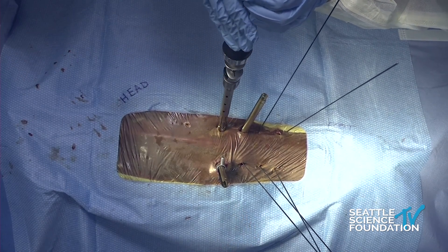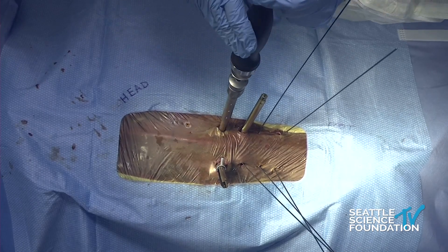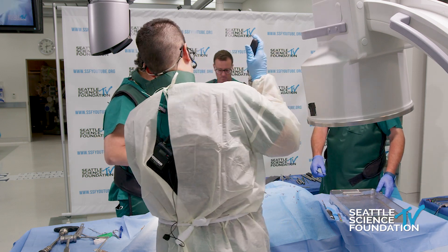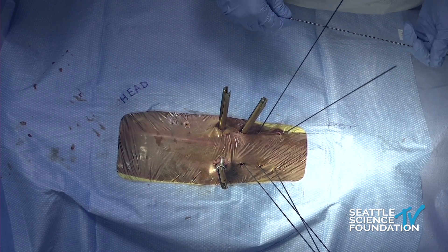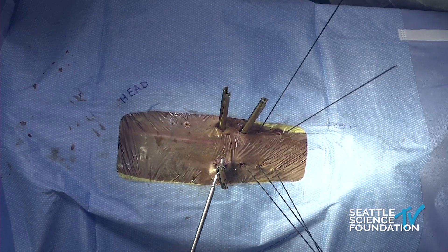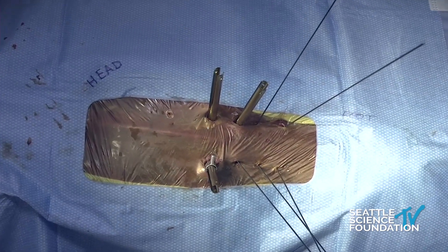Martin Fam asks: one of the complications of MIS discussed earlier was advancing the K-wire too far forward — what do you do to prevent that and how do you manage the K-wire as you start putting in all these instruments? I think you can do both. The companies now — for example SpineArt — have an instrument that's like a super-aggressive awl/drill, so you don't have to use the nitinol guide wire. But if you do use it, you just have to hold on to the nitinol guide wire, otherwise it can advance.